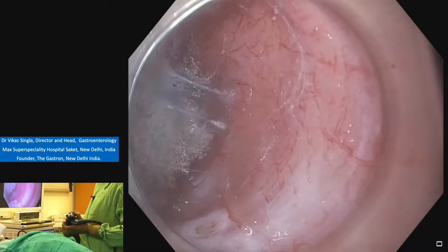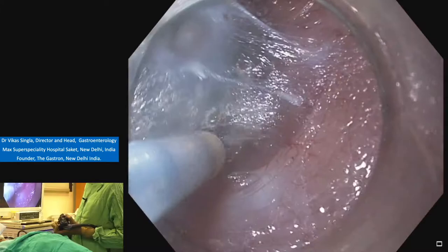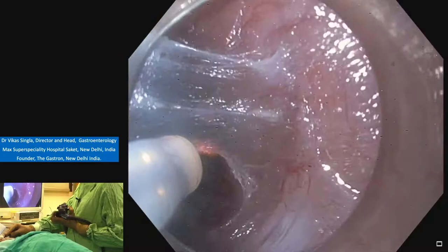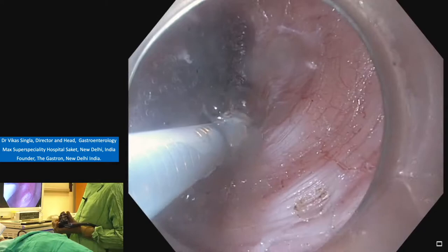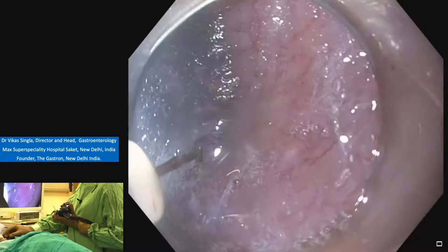Here on the right side, you can see the muscle, left side is the submucosa and the mucosal layer. Inject fluid, more fluid. Start from one side and then go to the other side. Open. Inject, start from one side, go to the other side.